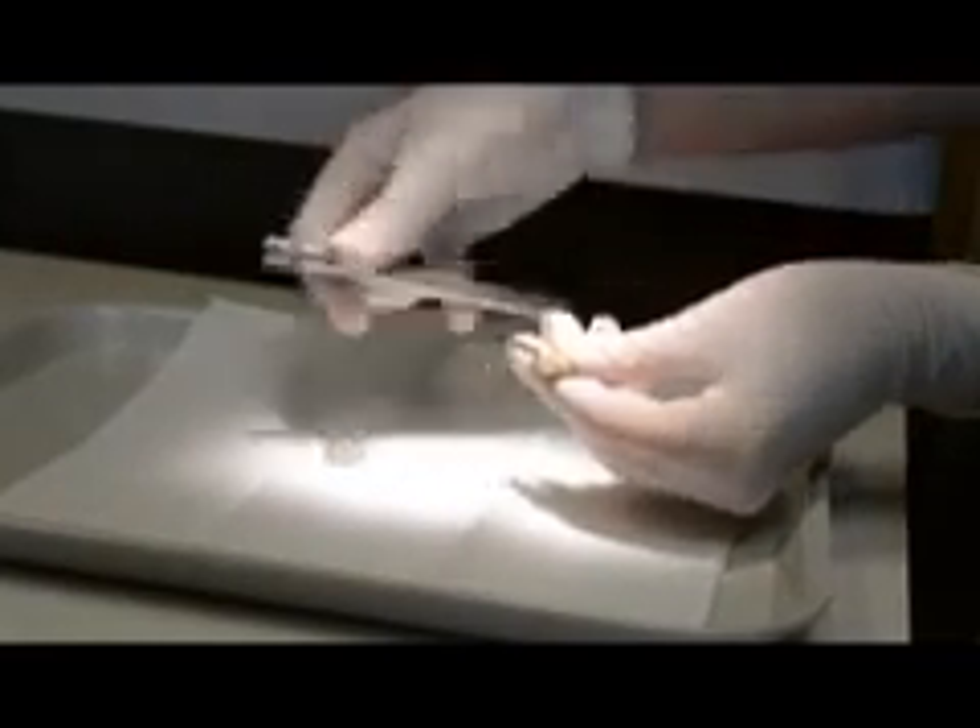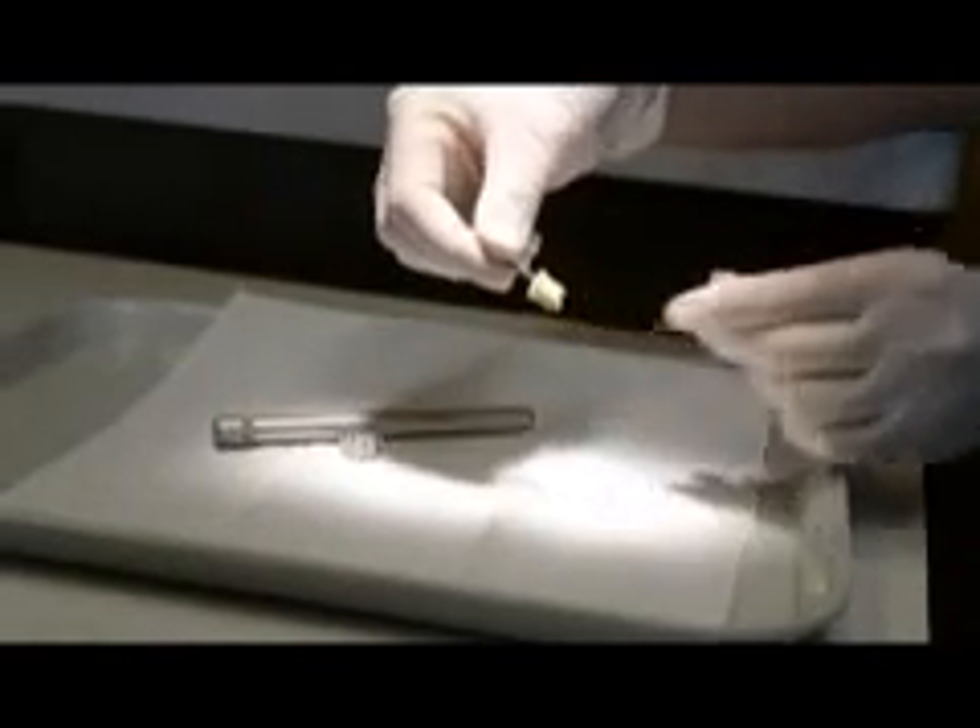When free, you can dispose of the root tip, extractor, and drill. The handle and knob may be autoclaved in preparation for another procedure.